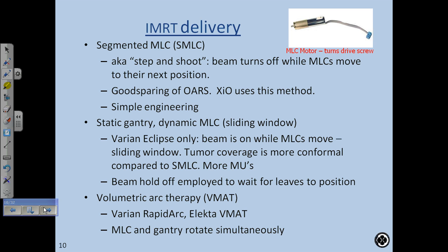Okay, and then volumetric arc therapy, that's the last one. This is RapidArc. VMAT is the general term; RapidArc is the Varian trade name. Elekta calls it VMAT, and that's when the MLC and gantry move simultaneously. We just talked about that.